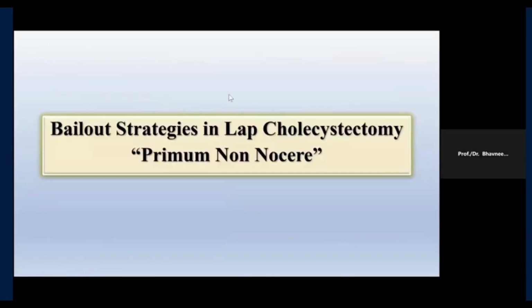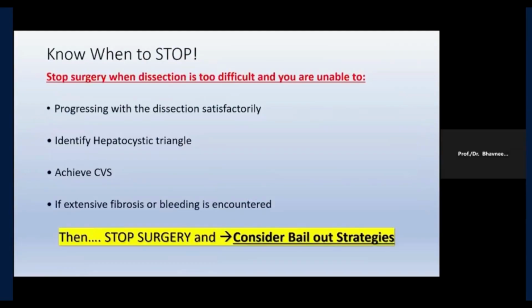If you're not able to make any progress, then what should be done? What are your options? How to take it to a conclusion without causing a complication? So remember, first, do no harm. If you are unable to complete the surgery safely, consider your options, reevaluate your options.